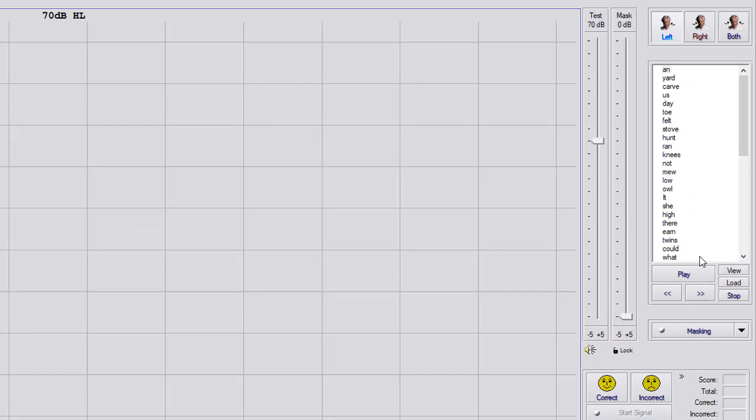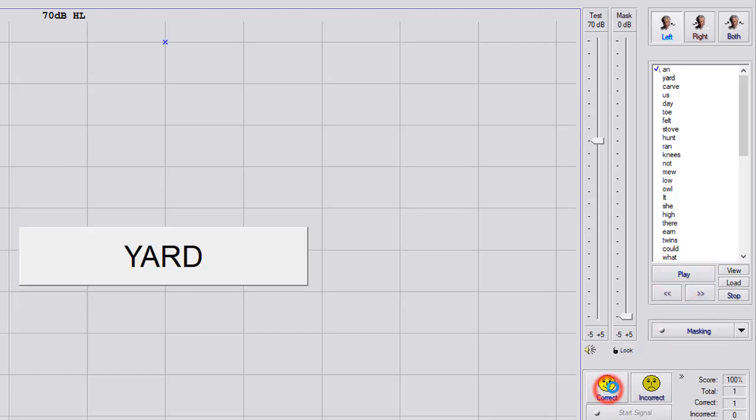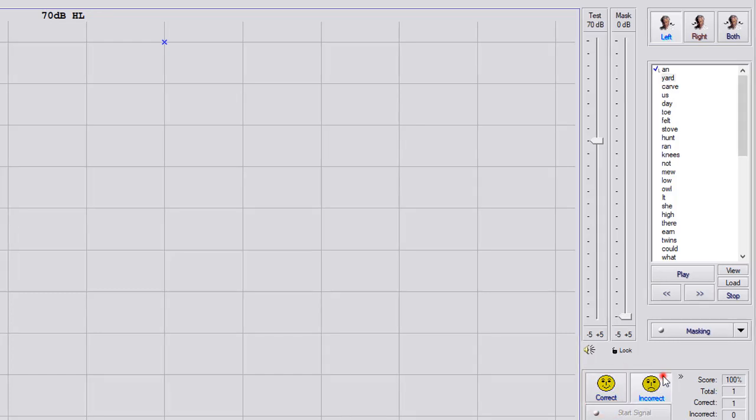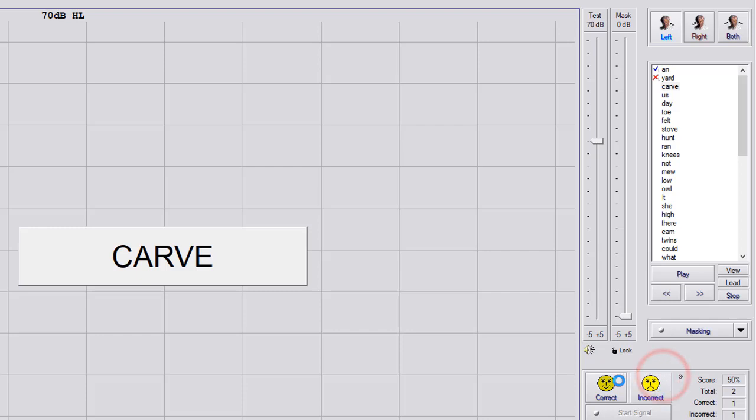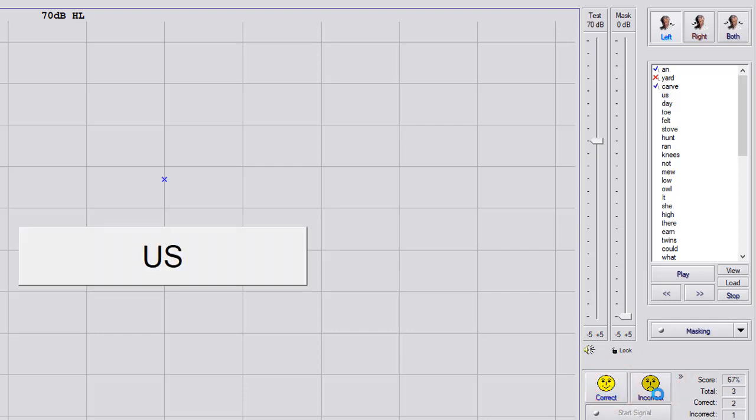And for this, it's going to automatically advance after you hit correct or incorrect. So you'll hit play, it's going to say the word. Now, you'll just hit correct or incorrect, and it's going to say the next word. And all you have to do is just hit correct or incorrect, all the way down the list.